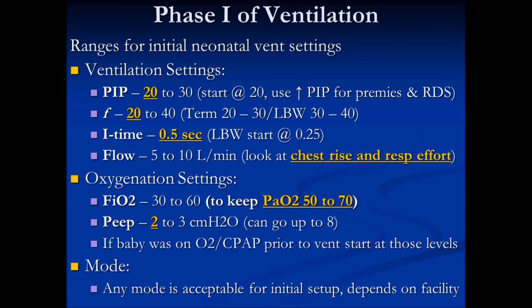So you won't start with the PEEP 2, and you won't start with the FiO2 30 because they were already on oxygen and pressure. So you want to go with those numbers.